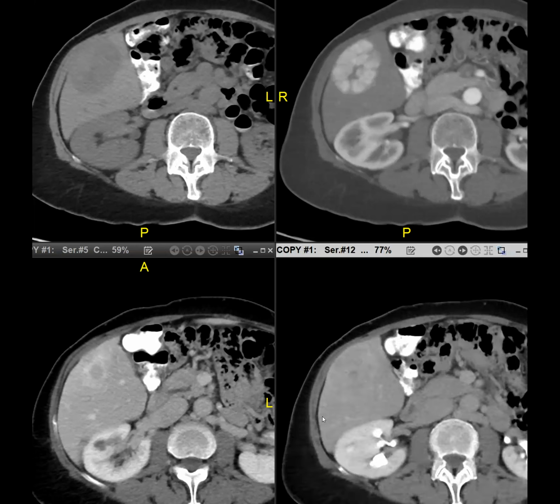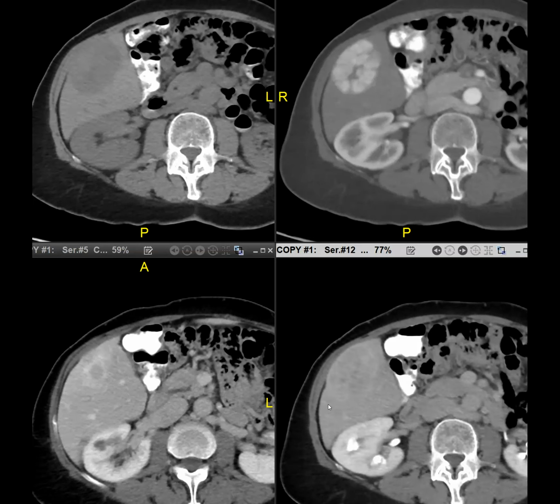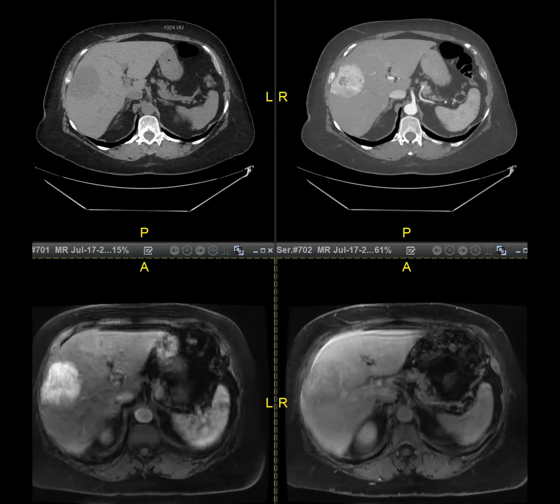I think this is a good case. But did they biopsy or get an MR before taking the patient for resection, or did they just say this is HCC? This is an old case, from 2008. This was read as consistent with malignancy and gave the differential, which is how, again, in a patient without hepatitis B or cirrhosis, this is a differential.